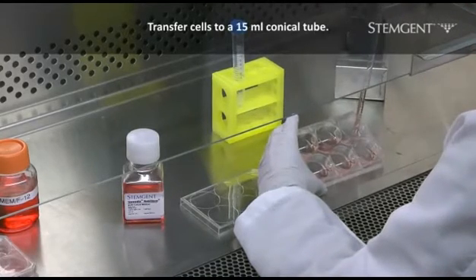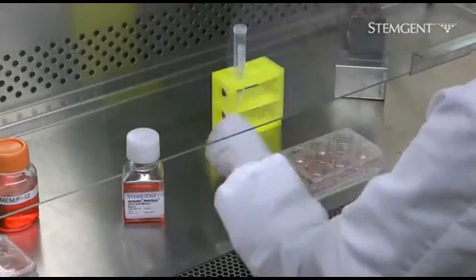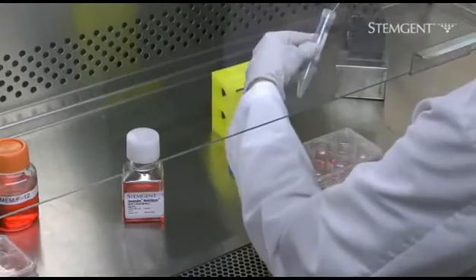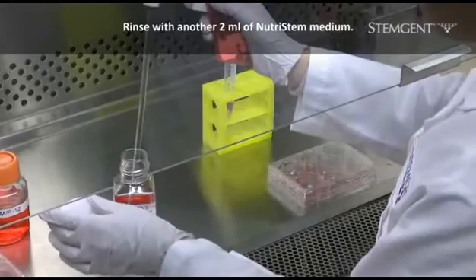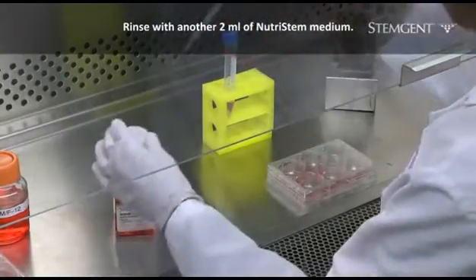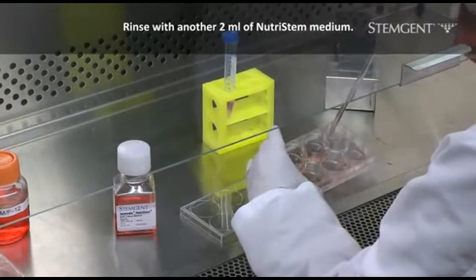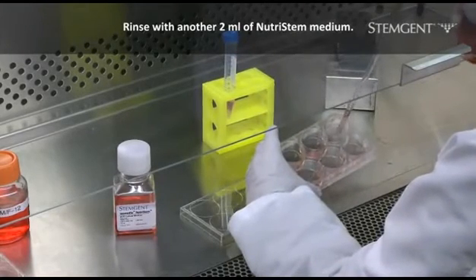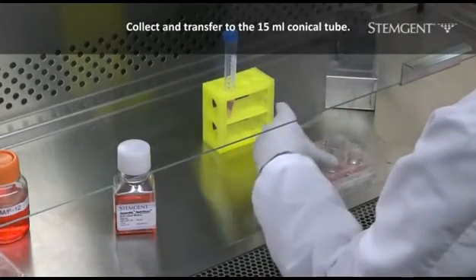Transfer the cells to a 15 milliliter conical tube. Rinse the well with another 2 milliliters of NutriStem. Collect the wash and transfer to the same conical tube.